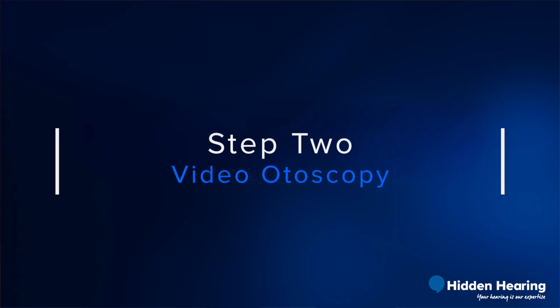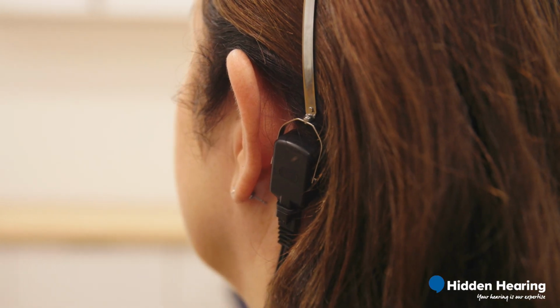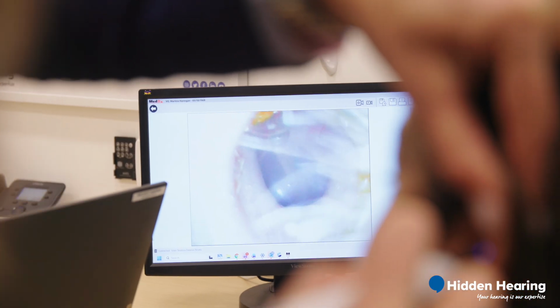Step 2 is a videotoscopy. Before we begin that, we explain to the patient why we do it. So what we do is we begin by examining the back of the ear first. Around the ear, we touch the mastoid bone to make sure that there's no pain or swelling. Then we proceed with videotoscopy where the patient can see what we are looking at ourselves on the screen in the room, and they can see if there's any wax blockages, if there is an infection, if there is a perforated eardrum, and from there onwards there's no stopping as the test goes ahead further.